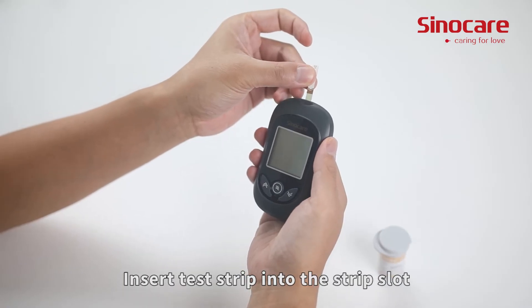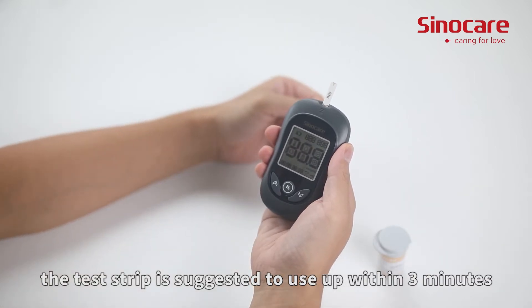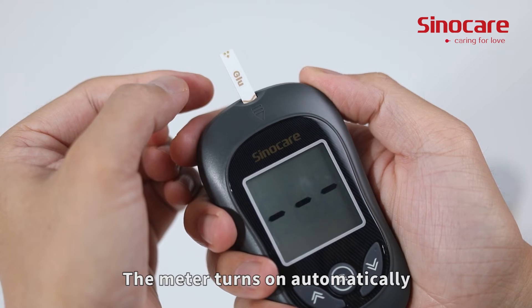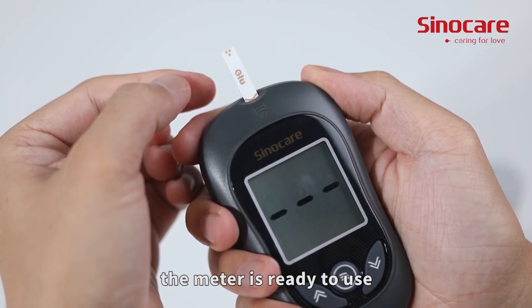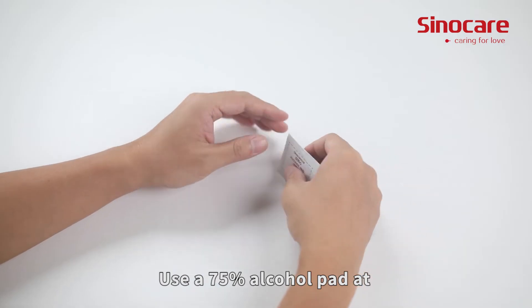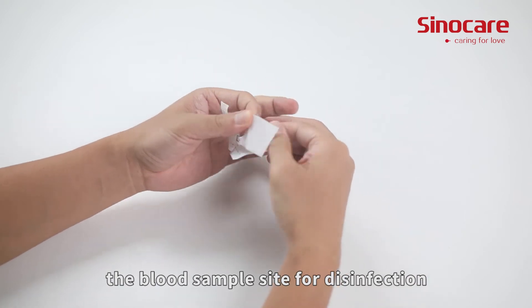Insert the test strip into the strip slot. The test strip should be used within three minutes. The meter turns on automatically. When the blood symbol starts blinking, the meter is ready to use. Use a 75% alcohol pad at the blood sample site for disinfection.